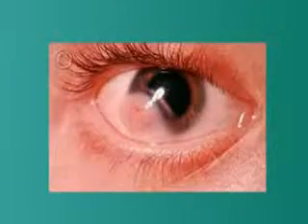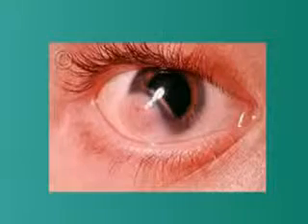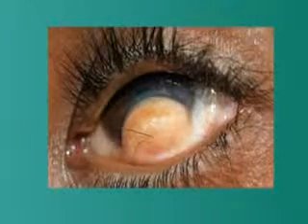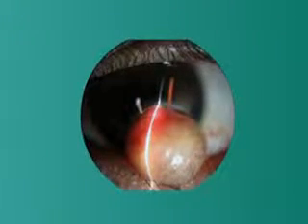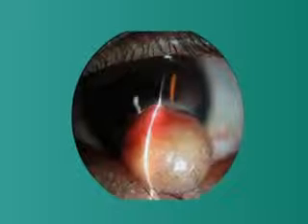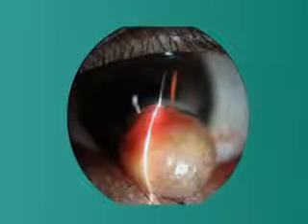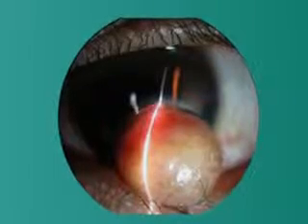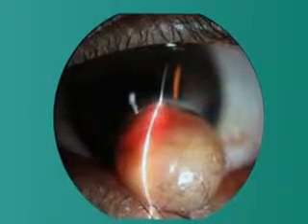Here, we demonstrate a surgery of limbal dermoid excision with lamellar patch graft to highlight the technique. Limbal dermoids are benign congenital tumors that contain choristomatous tissue, or tissue that is not found normally at that site. The limbal dermoids appear most frequently at the inferotemporal quadrant of the corneal limbus. Visual morbidity may result from encroachment of the lesion into the visual axis and development of astigmatism.